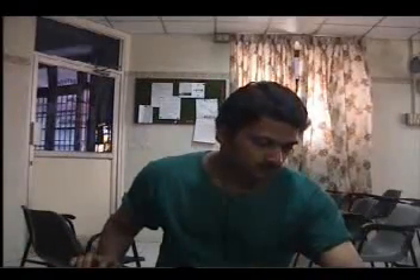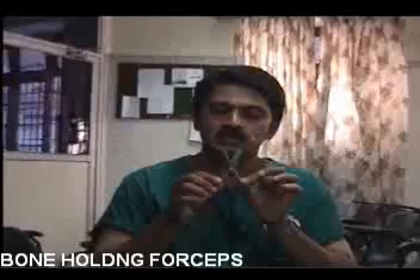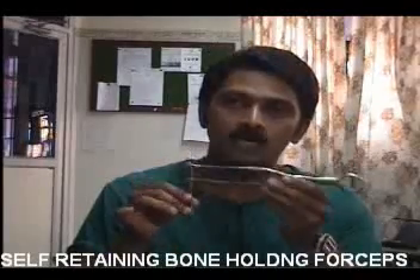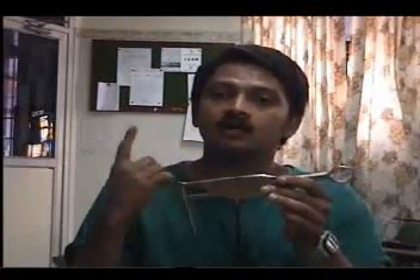Now we come to the bone holding forceps. Some forceps are just normal bone holding forceps. How do you know whether it is a bone holding forceps or not? First, you look at the jaw — just by looking at it, you know that it is meant to hold a bone. What you should look for after that is whether it is self-retaining or not. If it is self-retaining, you have to name it fully as a self-retaining bone holding forceps.